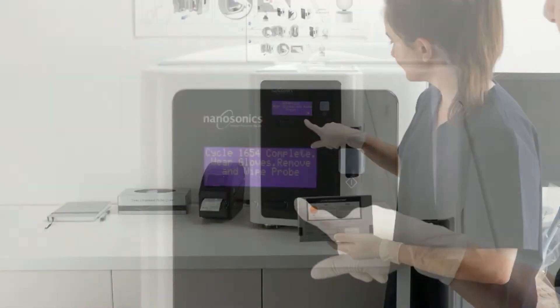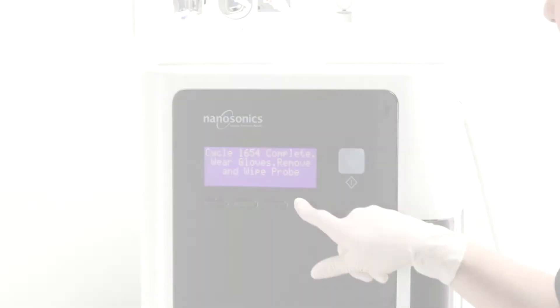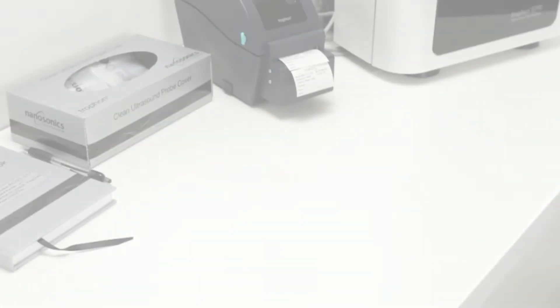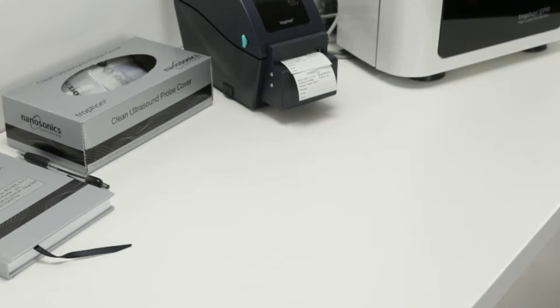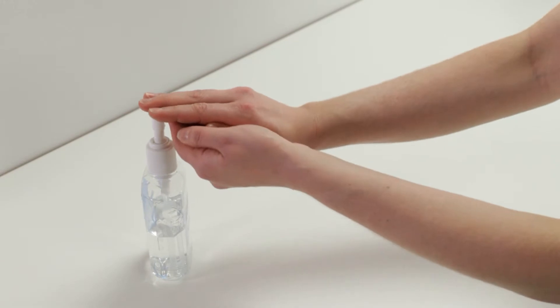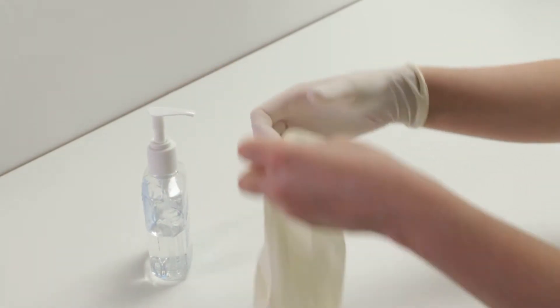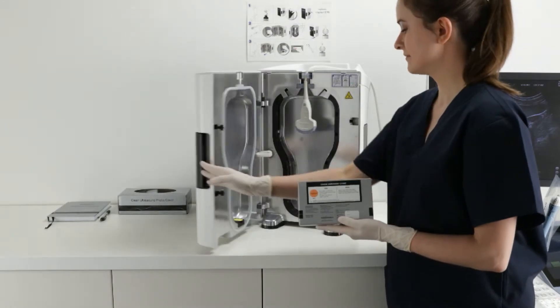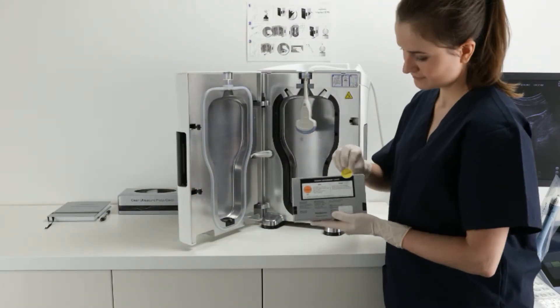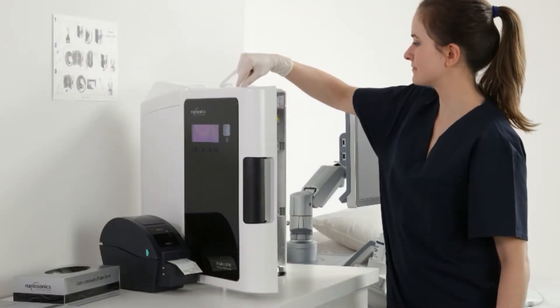Store. At the completion of the high-level disinfection cycle, TROPHON will beep once to indicate the cycle is complete, and the screen will display the message, Cycle Complete. If you have the TROPHON printer installed, a maximum of 4 labels can be printed automatically. Perform hand hygiene and put on a fresh set of gloves. Open the chamber door to remove the chemical indicator. Check the chemical indicator pass status using the color assessment chart. Dispose of the chemical indicator. Remove the probe and close the chamber door.